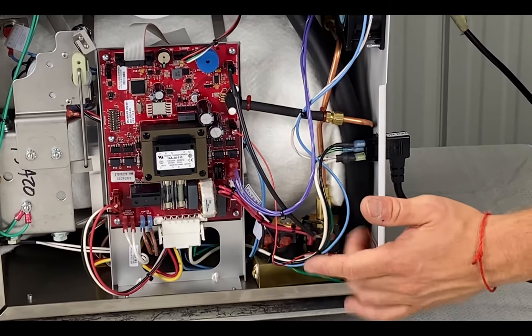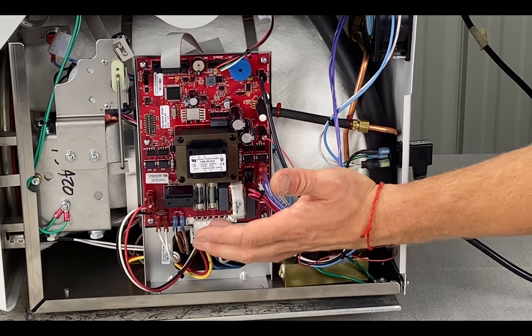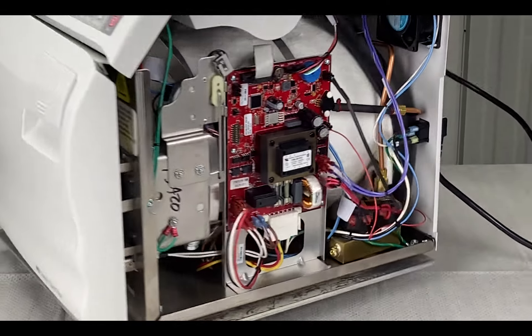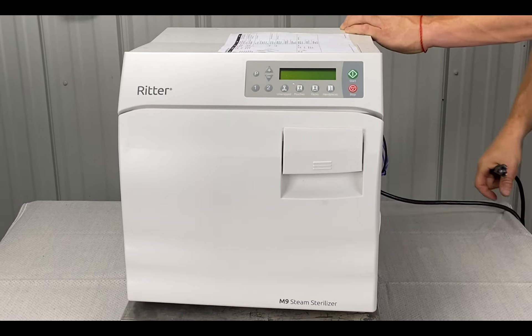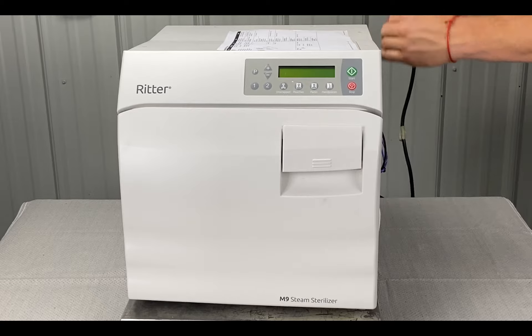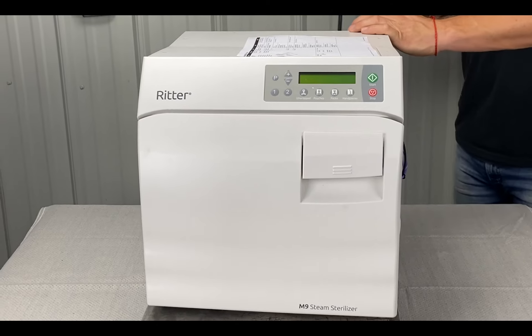Sometimes on the older model, it could be the main PC board fuse holders — they're melting, or your solder joints are bad. So it could be something like that. We can take care of you if that happens. We'll have to take out the right side panel and inspect that as well.